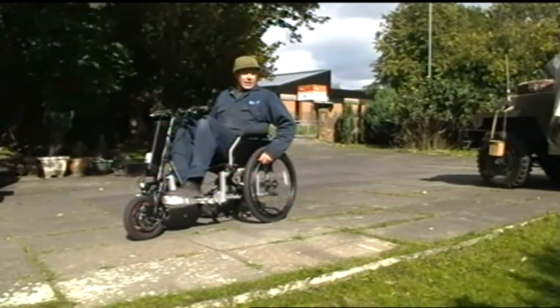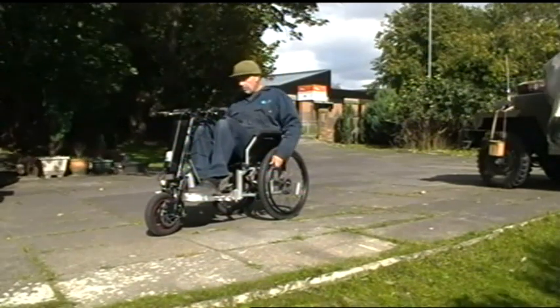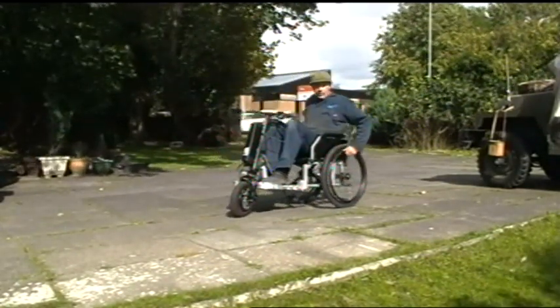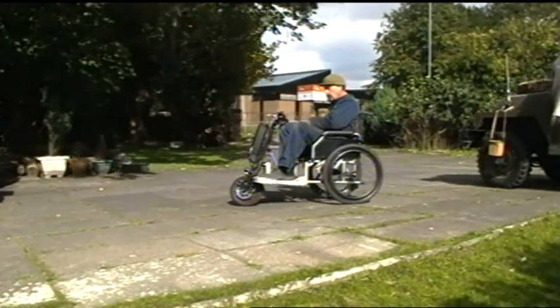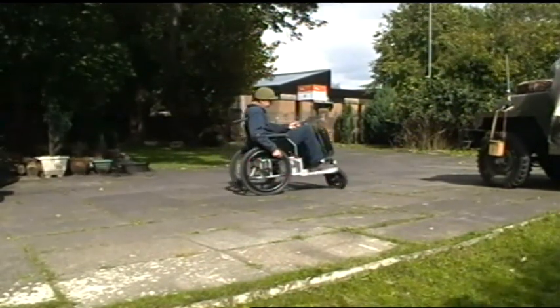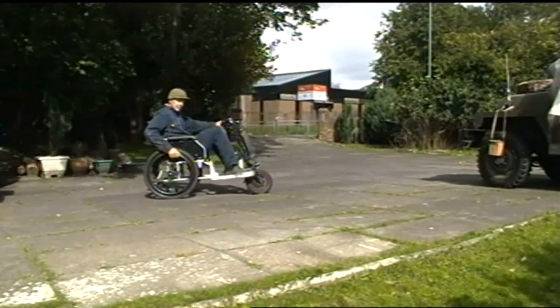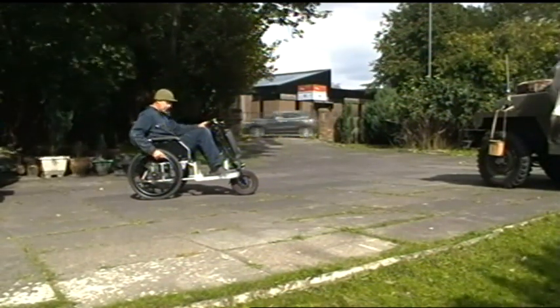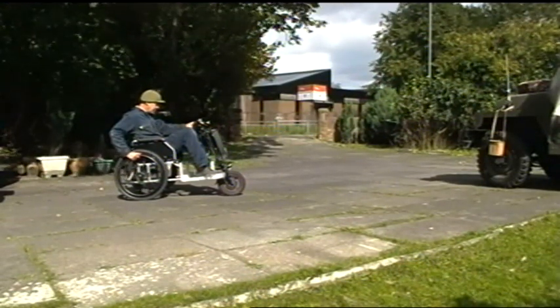If you want, you can still put the handbrake on. There we go. You can still back it up like that. And you can push it around like that if you want to. So if you get stuck, you can still move it with the handbrake or the handwheel. Put the power on.